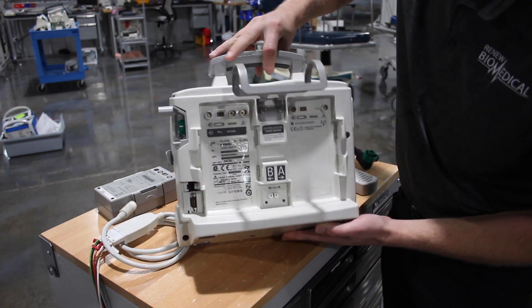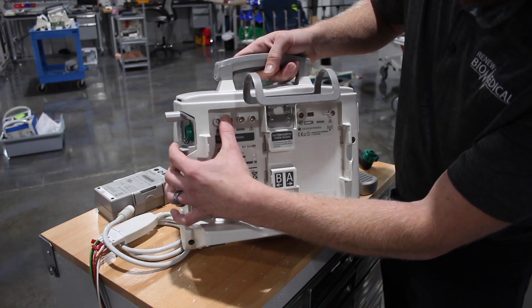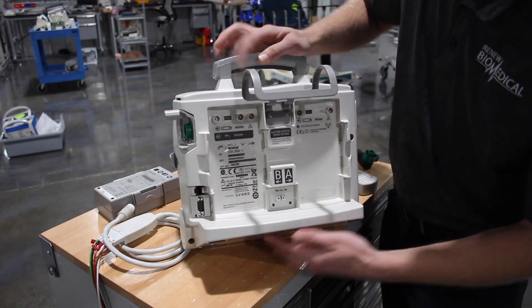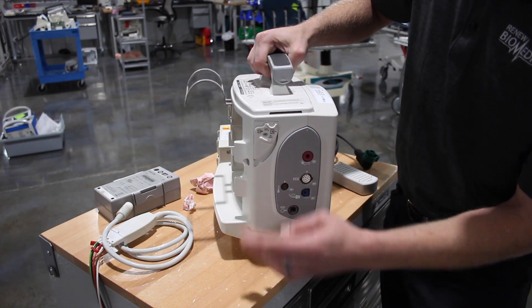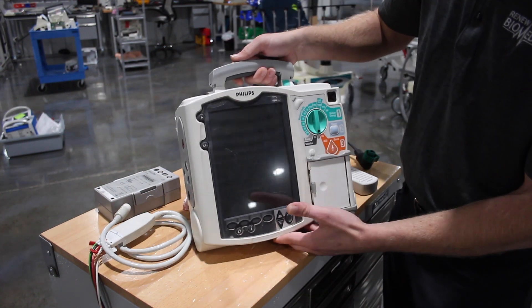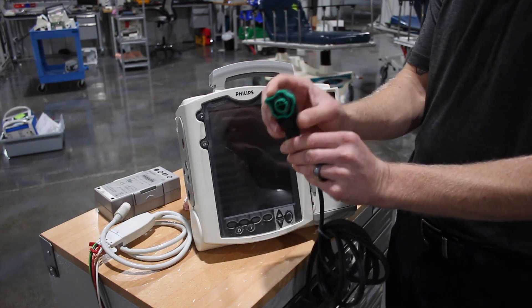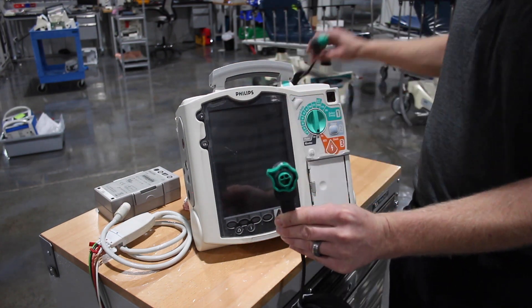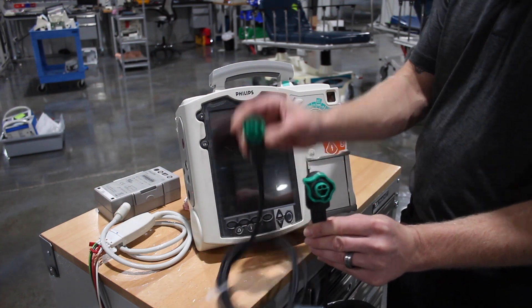On the back of the unit you're going to want to verify that your battery pins are flush — none of those are broken or bent on both sides. They've upgraded the CO2 so that it closes back, and they've also updated the therapy cable. The new therapy cable versus the old style therapy cable had three pins and no collar.